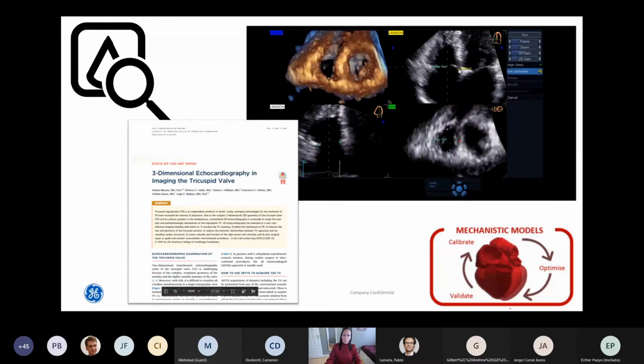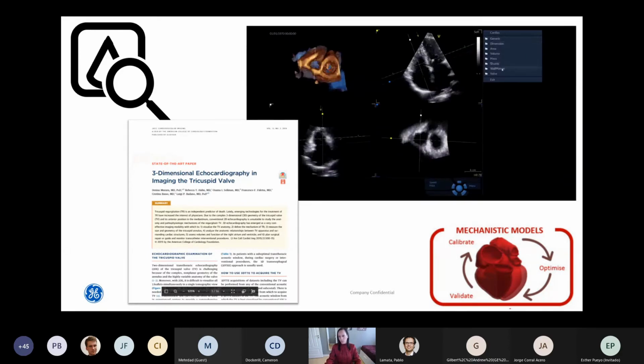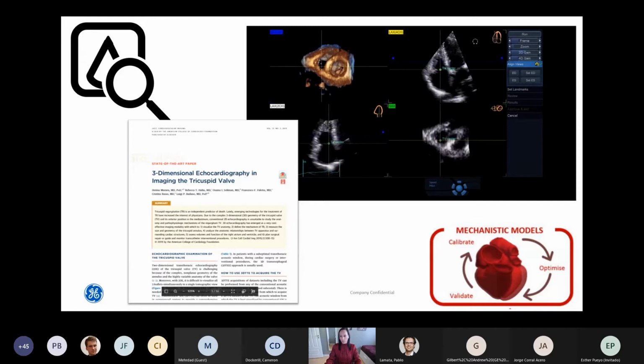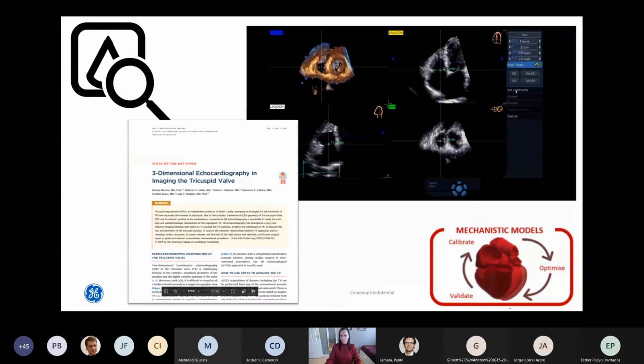And as you can see, this type of tool requires input from the user to place these landmarks. These types of solutions could be automated thanks to statistical models. So that's where we see these workflows going in the future, to automate this pipeline so that the user saves time in correcting these points and these different angles of the plane.